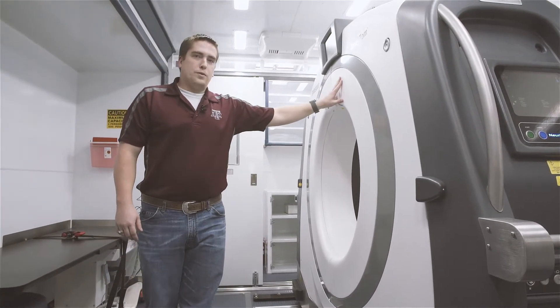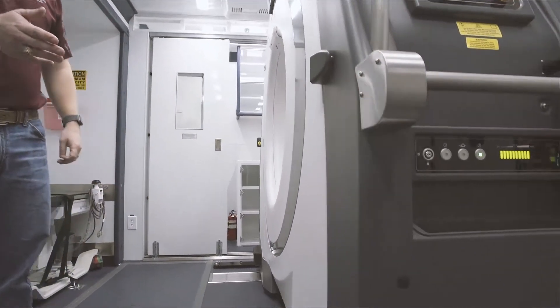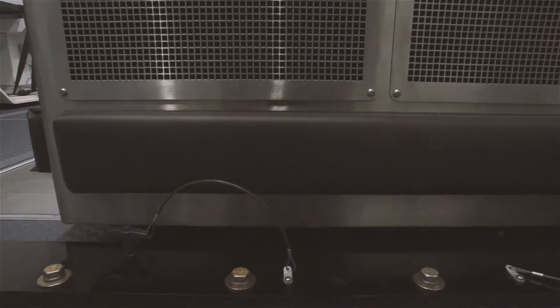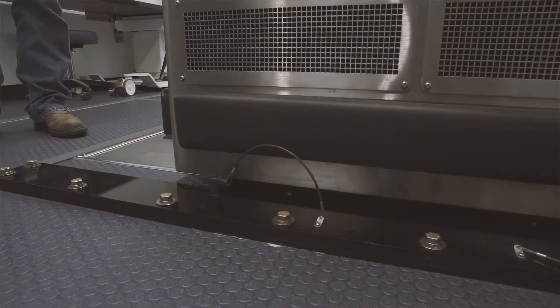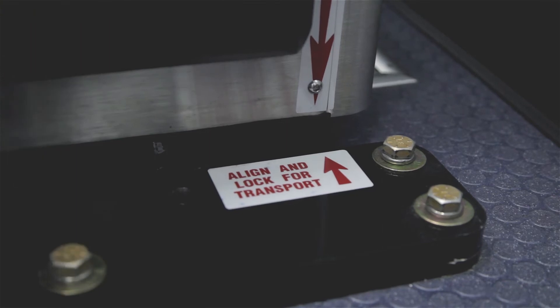It's currently in transport mode. At the end of the black plates you'll notice these T-pins that are helping to lock it in place, so this scanner is not able to move until we take those pins out and are ready to allow it to move.